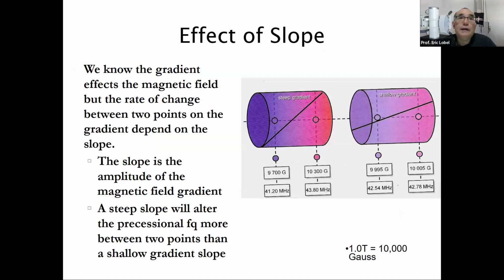But it's important because what the slope is, what the steepness of the gradient is, will determine the slice thickness, potentially. For phase encoding, that slope will determine where, in what line of K-space we place information into, towards the top, in the middle, at the bottom.